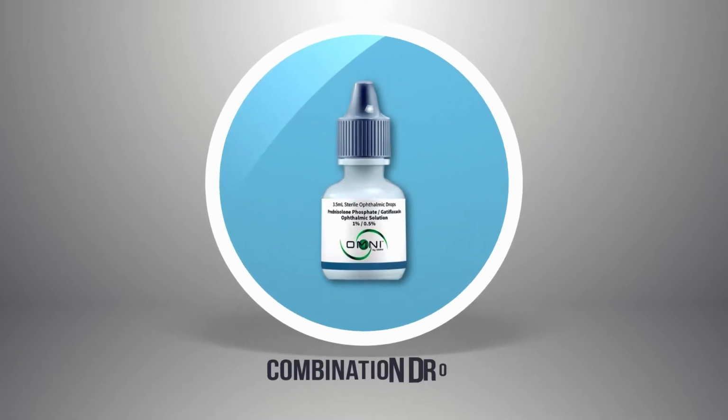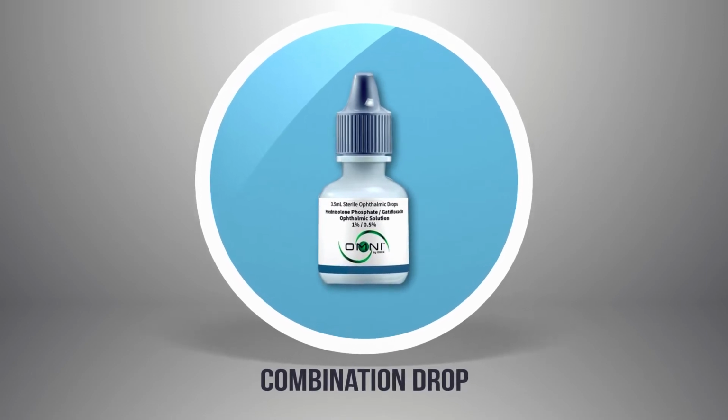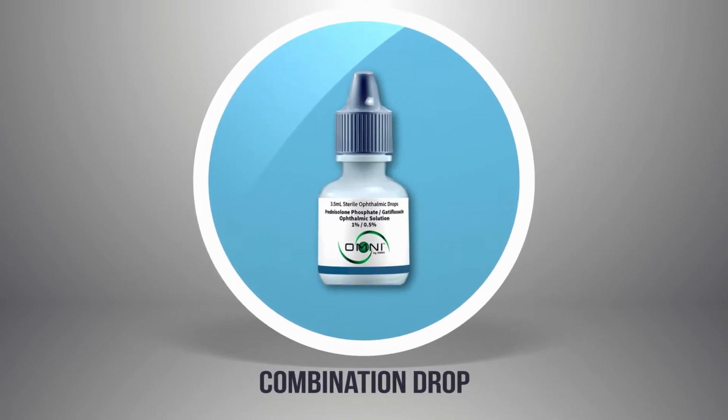When we're finished with the laser surgery, your vision's going to be blurry and it's going to remain blurry for 3 to 5 days. I'm going to put a contact lens on your eyes immediately following the surgery. These contacts act as bandages. You don't need to do anything with them. We'll take them out for you in 5 to 7 days. A combination prescription drop containing an antibiotic and a steroid is going to be given to you when you check in for surgery. This should be used 4 times a day at breakfast, lunch, dinner, and bedtime.